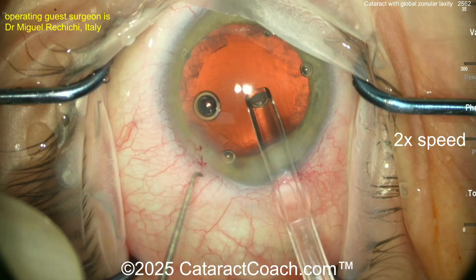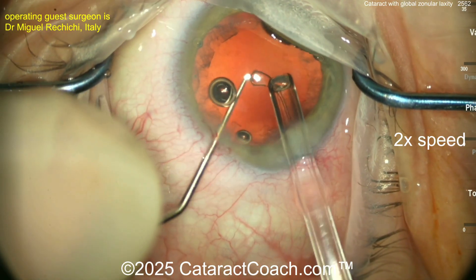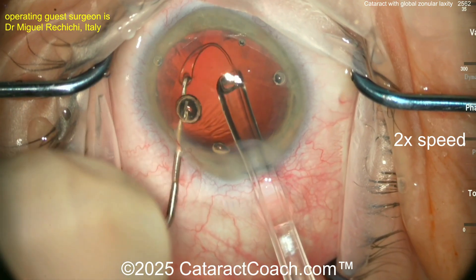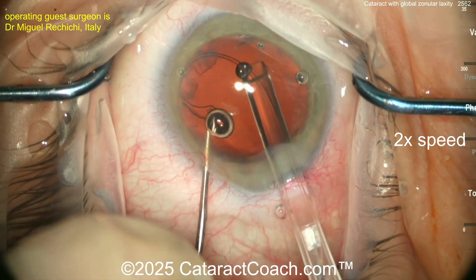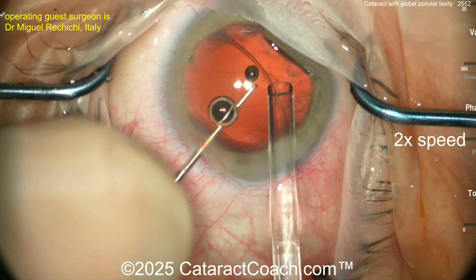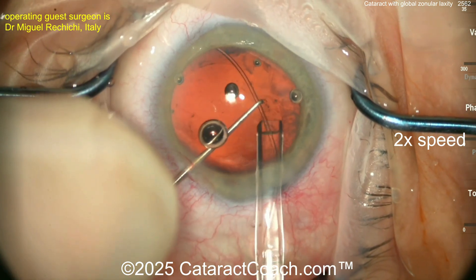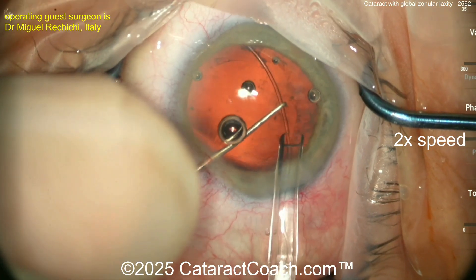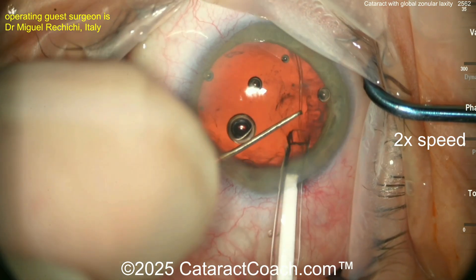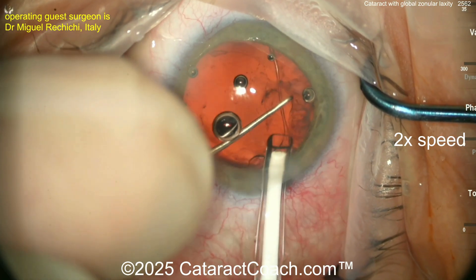CTR is coming out, aiming towards the left. Using the Sinski hook in the left hand to help deliver the CTR. Using the Sinski hook to guide placement — make sure it goes in the capsule bag. Once that's done, keep guiding it out nice and easy; it should go all the way around without too much resistance. If there's a lot of resistance, it may not be in the bag. But this looks great — right in the capsule bag.